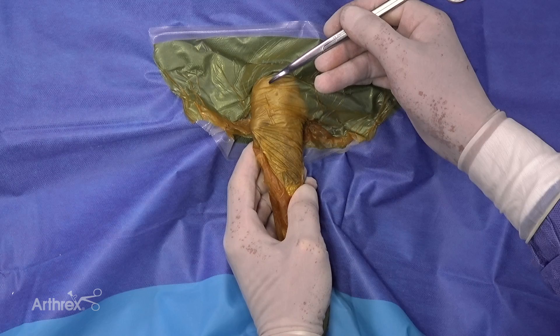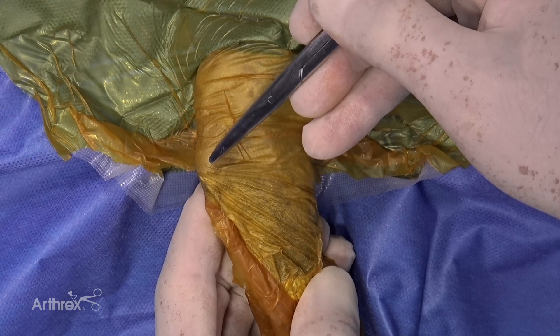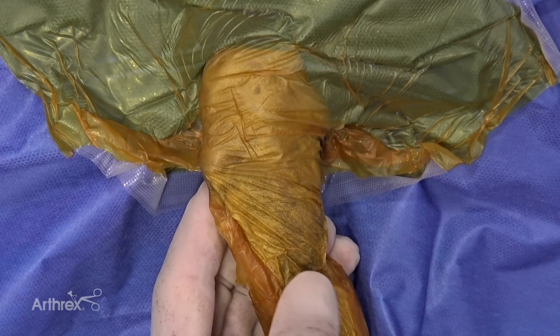We'll make a lateral peripatellar incision to explore the internal structures of the joint. This is the patella, patella tendon, tibial crest, and the lateral fabella is in this region here — that will be the femoral site. So we'll go ahead and make an incision.